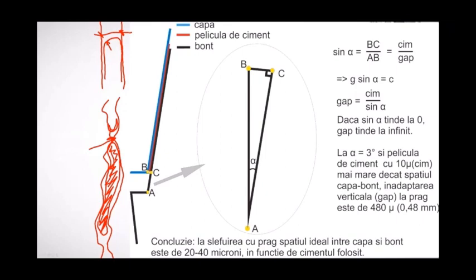If you look at the lateral view, you sometimes see that image, twisted, on the left. You say, oh, it has to be straight. It's not. If you look microscopically, at the dimension of microns or tenths of microns, it will look like that. That is our coping, and on the right side is our abutment.